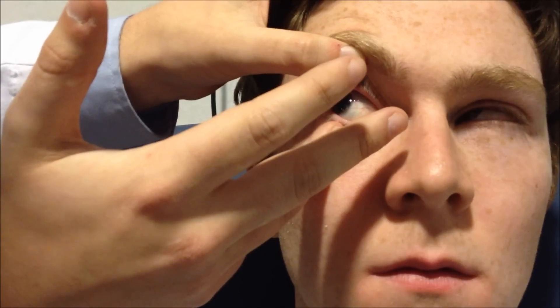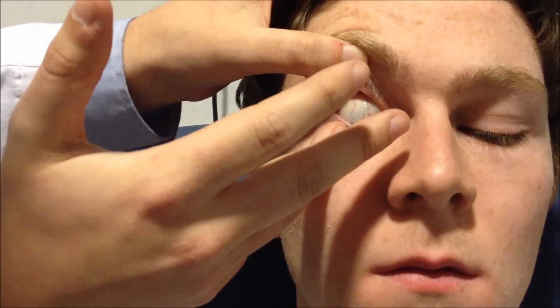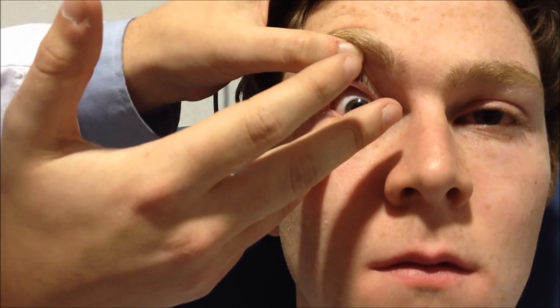If you look towards me, Sean — that's great — and look down, and look straight ahead. Just let it settle where it will. Blink for me. That's fine. At this point you can offer the patient a tissue, just to dab around like that.